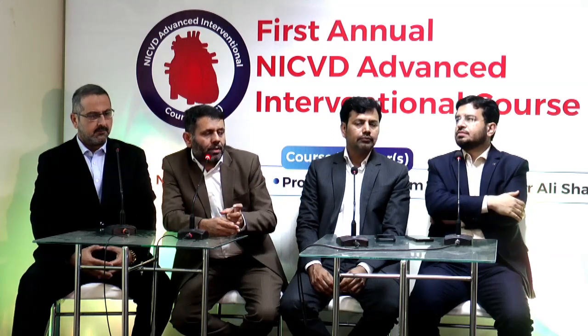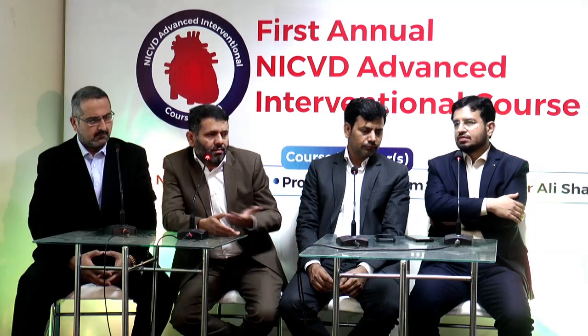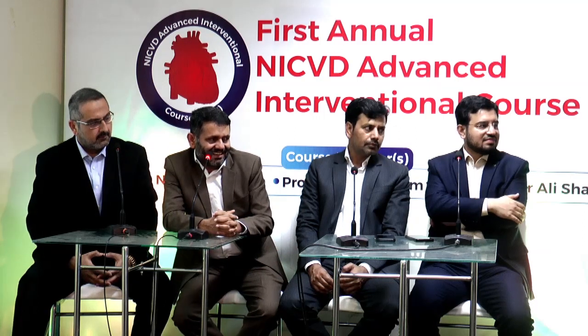It's just for LV support. In case I do the PCI and shut down the SVG to LAD, what will be the fate of the LV? The LV will go down directly. This is the only vessel. It's the only vessel of this patient. So far, you are secure. I completely agree with you. That was the only point I was trying to make.